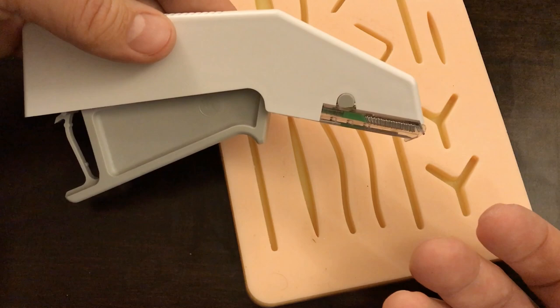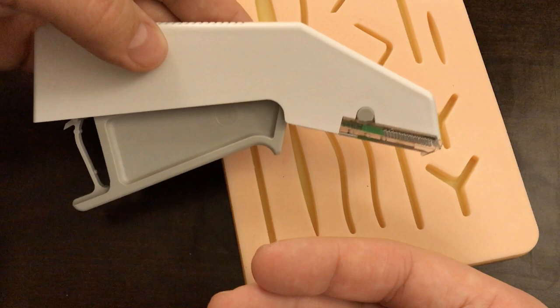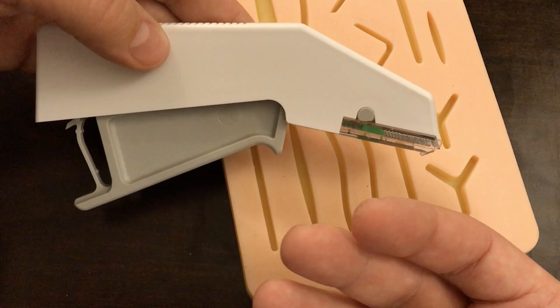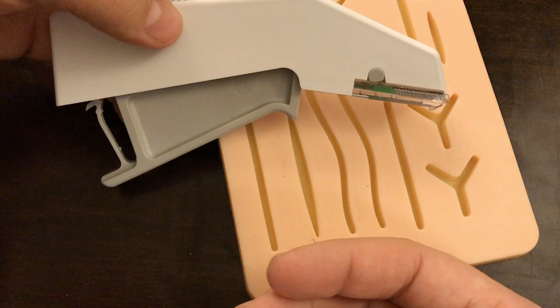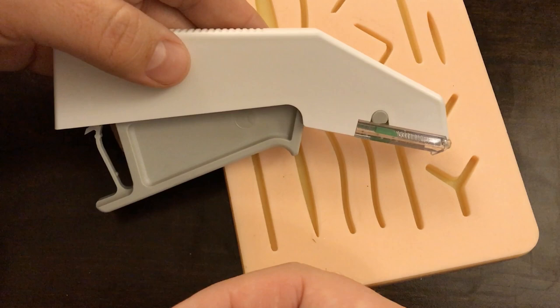One of the main advantages of a stapler is that it's much faster and a little easier. It doesn't require as much skill and it's a little harder to mess up. The staples and sutures generally stay in for the same amount of time — they both have to be removed unless you've used dissolvable sutures. Really, the biggest advantage is that stapling is fast and pretty simple.